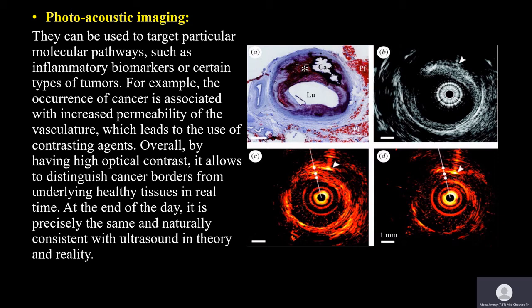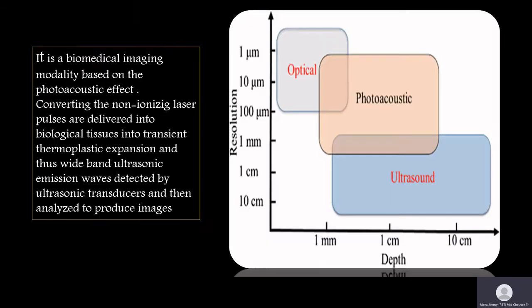As we see in these color changes, it depends on, number one, the amount of blood, number two, the amount and type of hemoglobin in this blood, and number three, the amount of angiogenesis in these tumors, and we can say this tumor is growing aggressively and exposed to metastasis. Again, as we see in this diagram, photoacoustic imaging is a combination of optical imaging and ultrasound imaging to quantify the properties of the ultrasound scan, with the advantages of ultrasound imaging: deep field visualization, X-ray-free imaging, and sound sensors properly coupled to the wavelength from the optical imaging corresponding to the target.